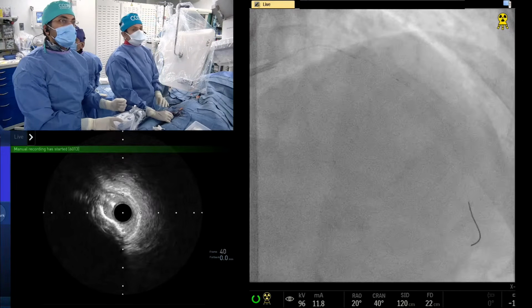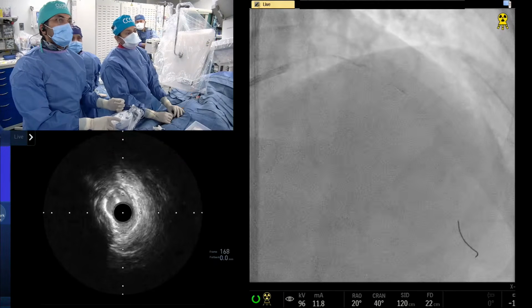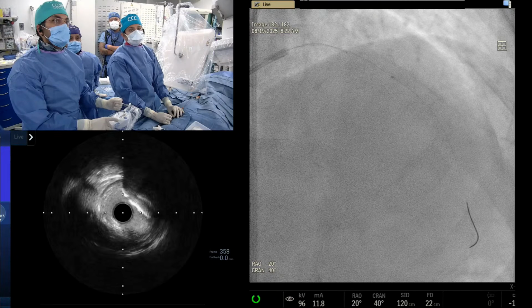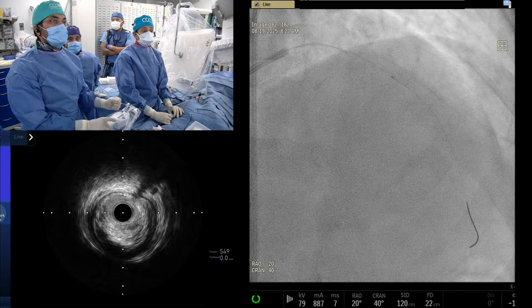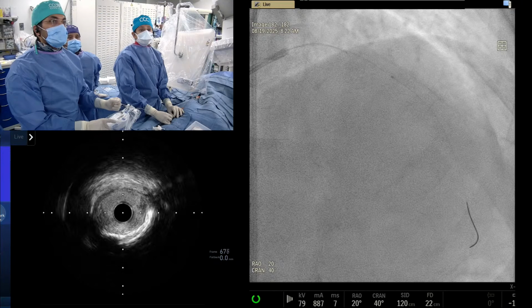So now manual recording. We are recording. Okay, recording. Yep, I'm doing manual. Eccentric calcium. This is some septal. Look at it. Just here's a lot of plaque burden, no calcium. It's true. Proximal part doesn't have much calcium. It's all eccentric, fibrous and deep calcium here.